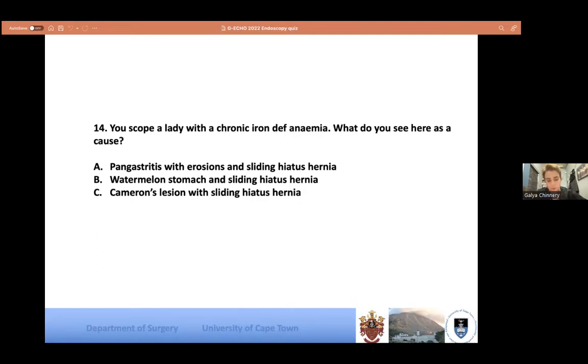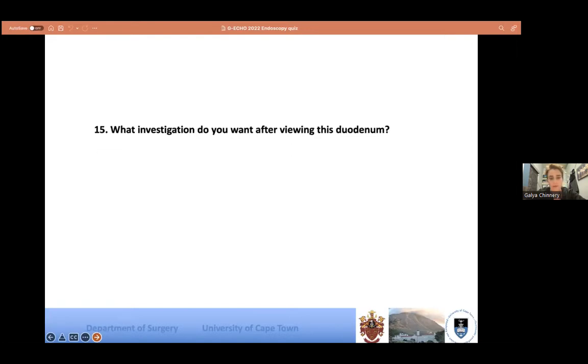You will notice though that they're always a bit lower down once you do your scope, and that's got to do with your insufflation. Insufflation artificially changes the position, so you might miss them. So you should actually be aware that, I hope you saw them on this, that they were a bit lower down than the indentation of the actual hernia on the diaphragm.